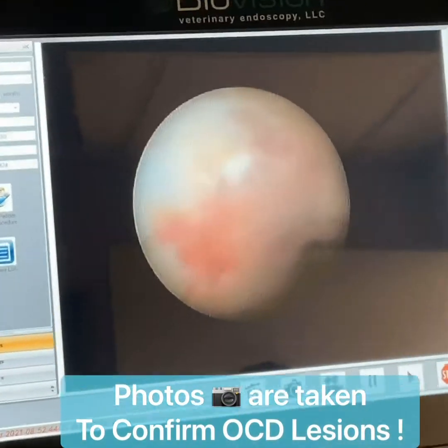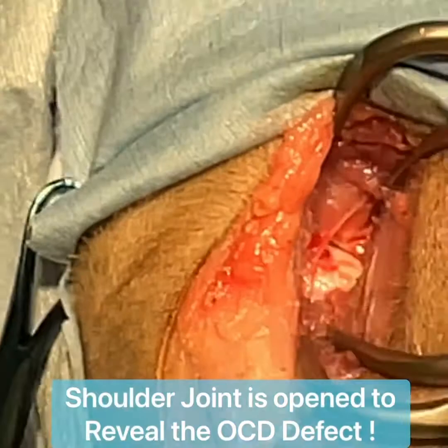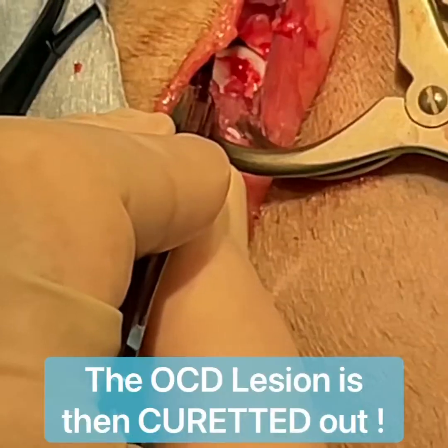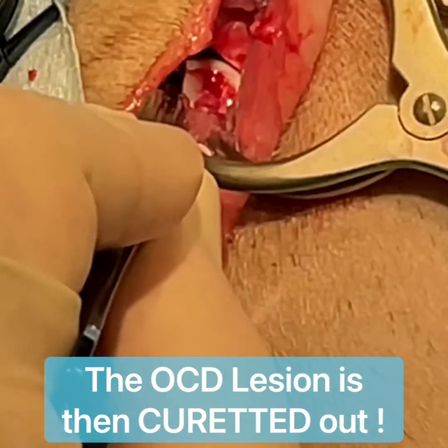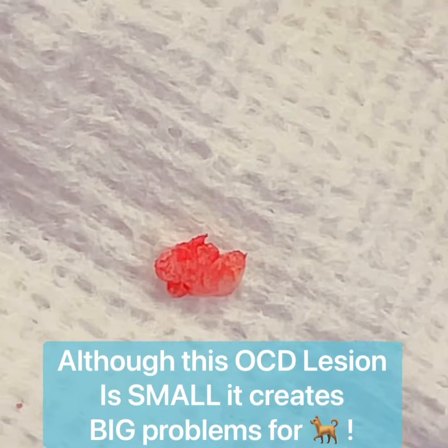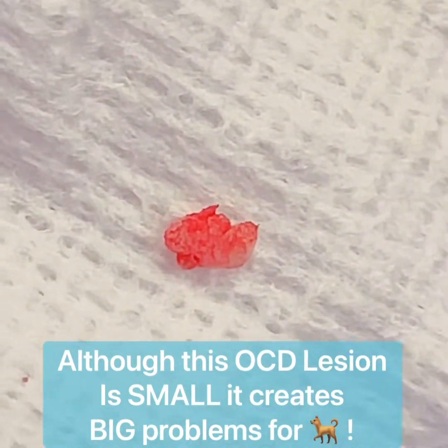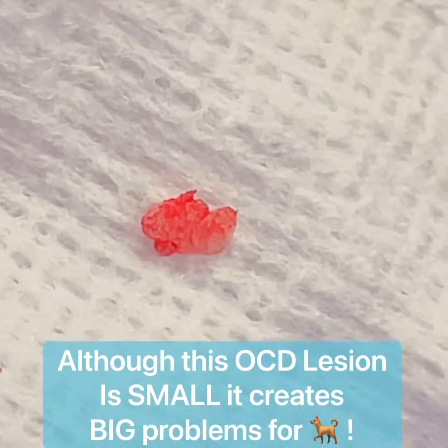Here we have a lesion on the other side that we're going to be taking out as well — that's a smaller defect right there. Here's an example of a piece of the defective cartilage that was inside this joint, causing all this pain for this patient. Now it's been removed.